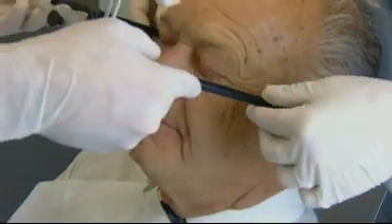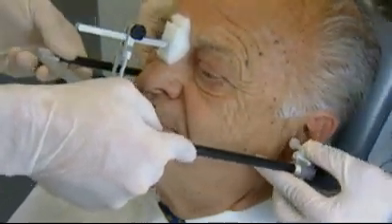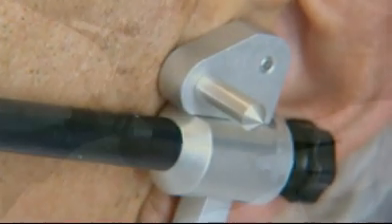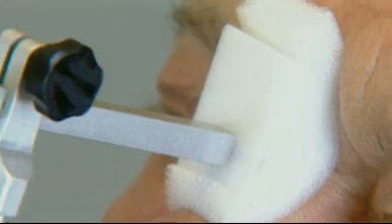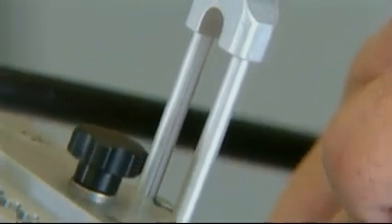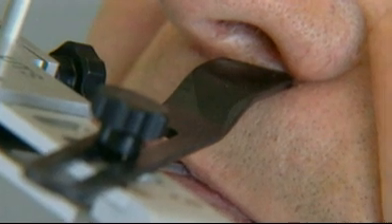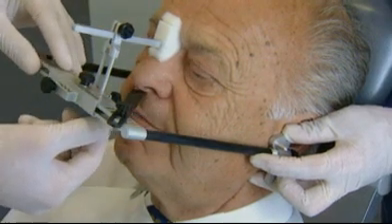Mounting the UTS. In the present case, the Camper's plane was selected as the reference plane. Insert the earpieces into the external auditory meatus of the patient by slowly pushing the side arms together. Position the nose piece with the corresponding nose pads on the glabella in such a way that the bow sits tight. Adjust the reference plane indicator according to the spina nasalis by adjusting the height of the nosepiece. Check again if the transfer bow sits tightly and if the desired reference points are in line.